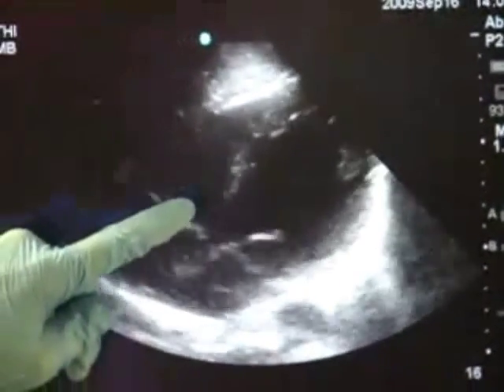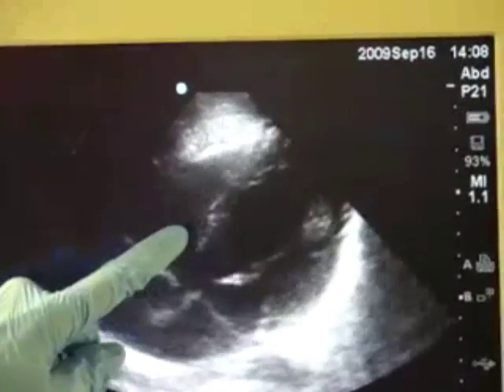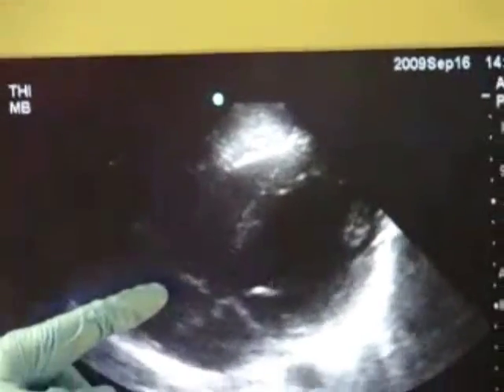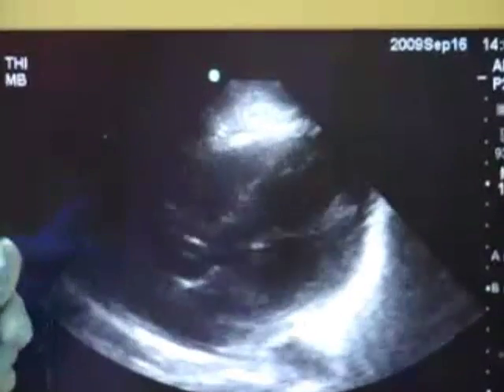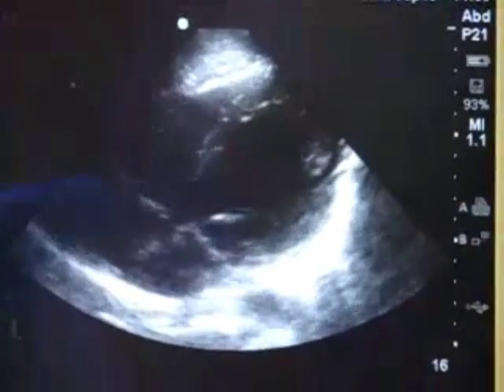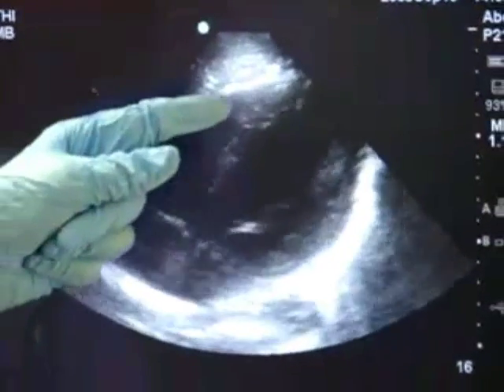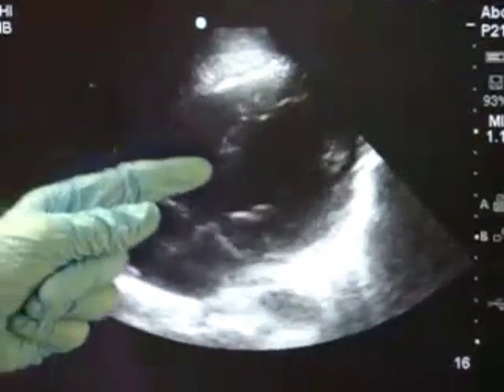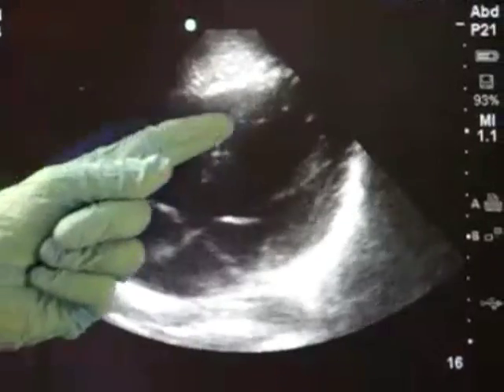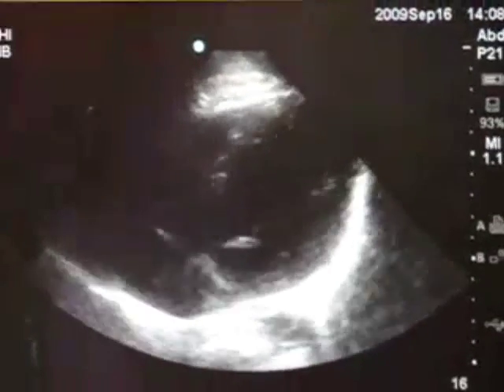You can see in this picture that the right ventricle is smaller than the left ventricle, and the wall of the septum bows out into the right ventricle, which is expected given the higher pressures of the left ventricle. In the case of, for example, a saddle embolism or other causes of pulmonary hypertension, the right ventricle can grow to be larger or as large as the left ventricle, and the septum can bow out into the chamber of the left ventricle.